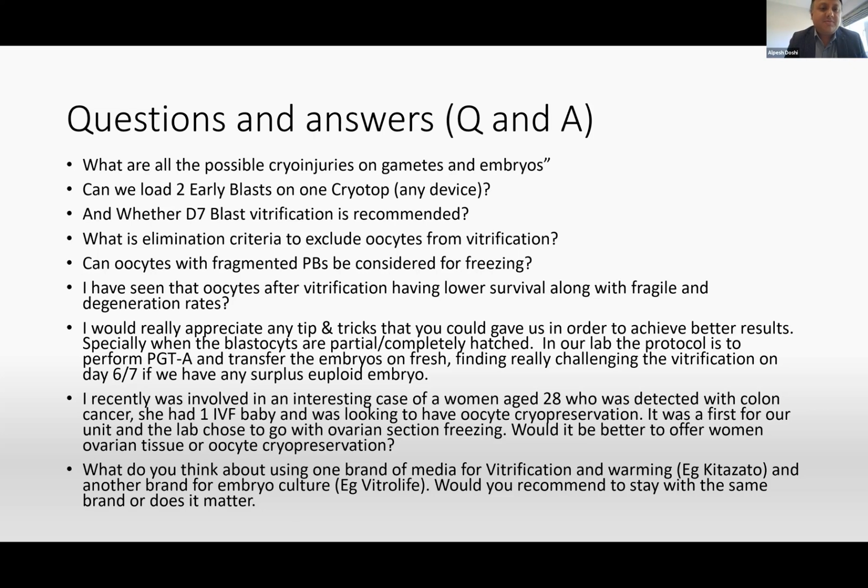Okay, one of the questions was, what are the possible cryo injuries on gametes and embryos? So cryo injuries could be osmotic stress or manual injuries during the freezing and thawing process. So again, as I was saying, we've talked quite a lot about the different possible areas where you can damage eggs and embryos during the handling.